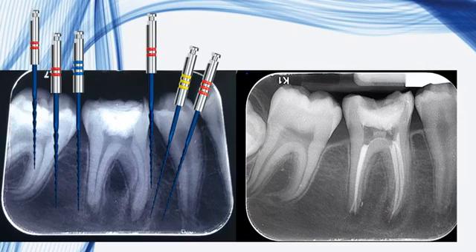Okay. Well, forget about the first molar. The patient is not having anything on that molar. She's okay, believe it or not. Miracles happen, but she's having pain in the second lower molar. Okay, there were only two canals, two big white canals, and radiolucency at the apex.